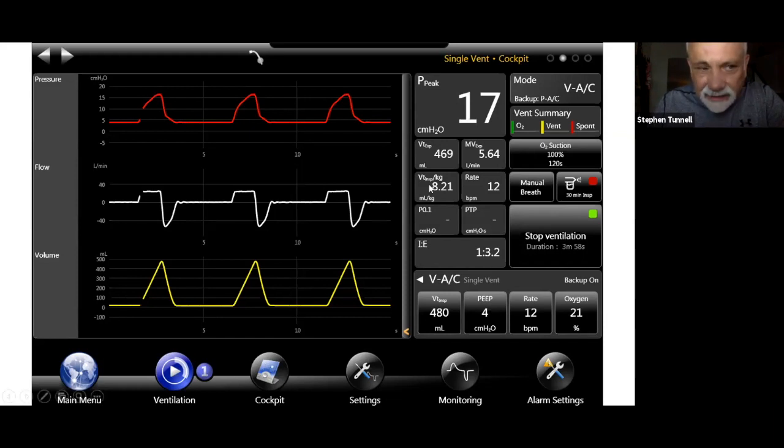On COPD patients, I'm interested in keeping an eye on their airway resistance and their compliance. I think on ARDS, I'd also probably want those two pieces in there. And again, it would just depend on the patient type, where they were in the course of their disease, and how I would configure what I wanted to see.